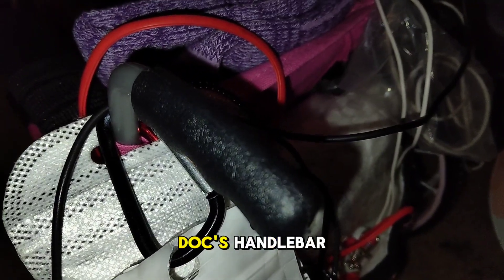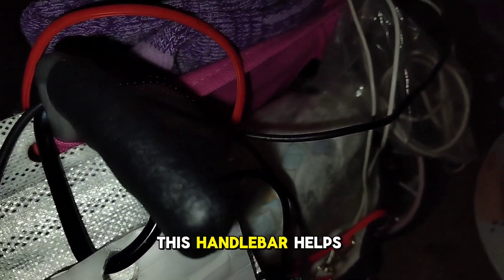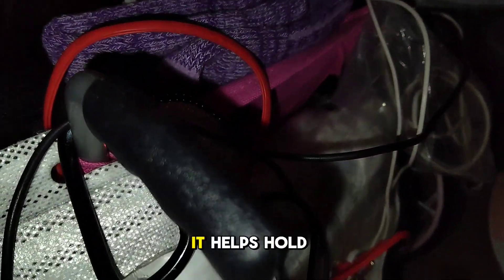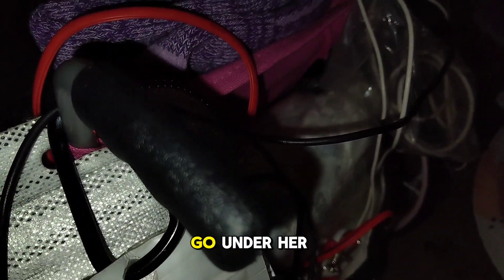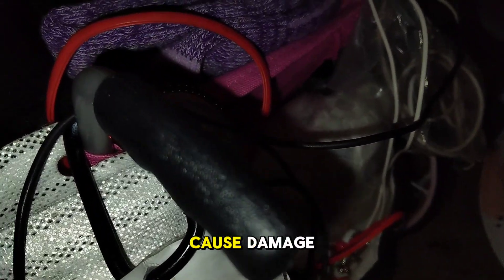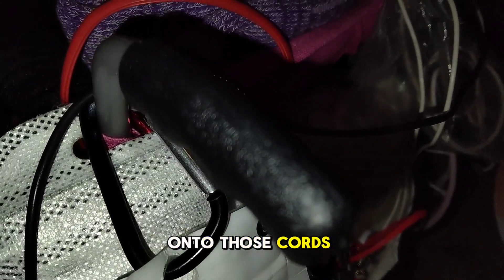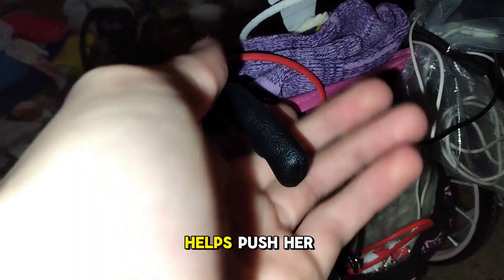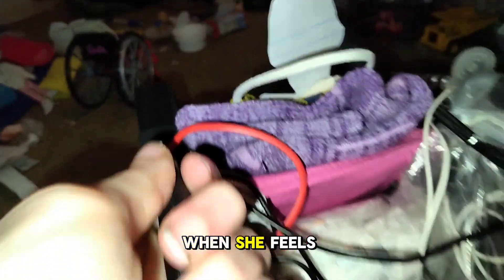Next up is Doc's handlebar. This handlebar helps with a lot of things. As you can see in the video, it helps hold all of her bags that have little clips on the end. It helps hold the cords so they don't go under the wheels and cause damage onto those cords and wires that go with her at night. And it also helps push her chair whenever she needs it when she feels weak.